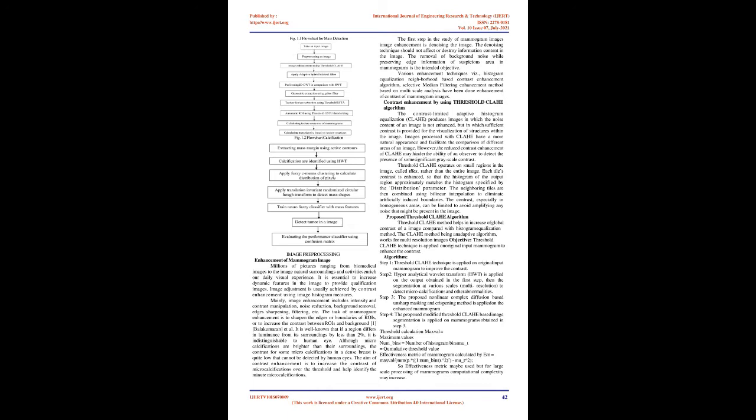Precision mammogram image analysis. Digital mammograms are very useful in detecting microcalcifications to diagnose breast cancer at an early stage. Image processing techniques such as contrast image enhancement, noise removal, segmentation, feature extraction, shape analysis can be done using digital mammograms. The given mammogram image is decomposed into multi-resolution hierarchy of localized information at different spatial frequencies.